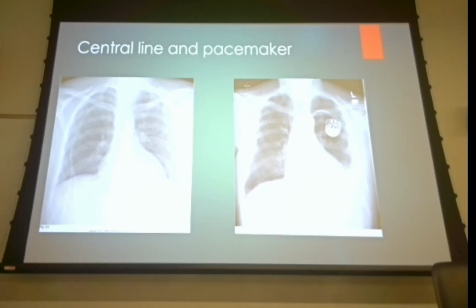This needs to be a consideration too. Let's say you walk into the patient's room and you see a tray on the bedside table, blood all over it, guide wires, all the stuff, the needles, all the stuff that you would see if they put a central line into the patient.